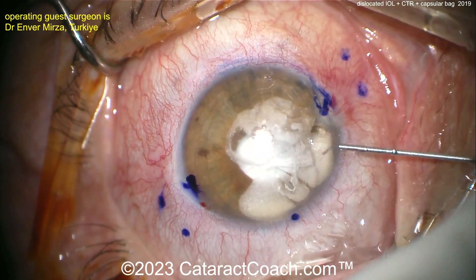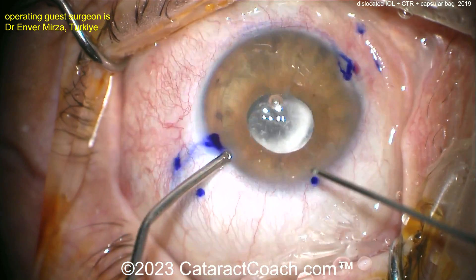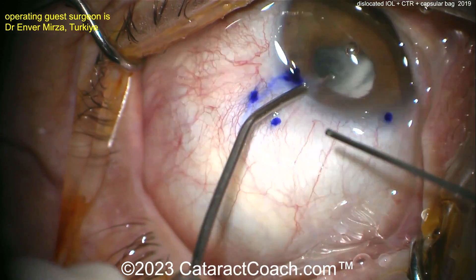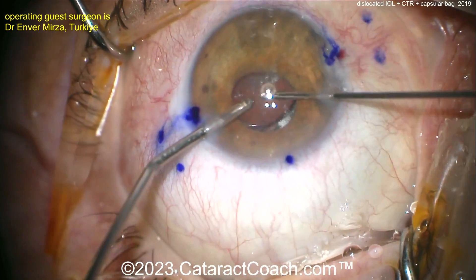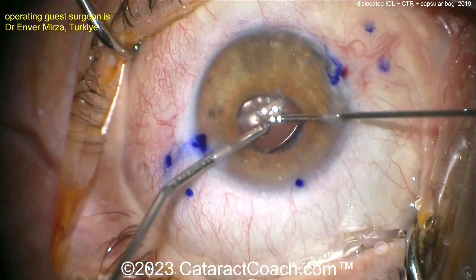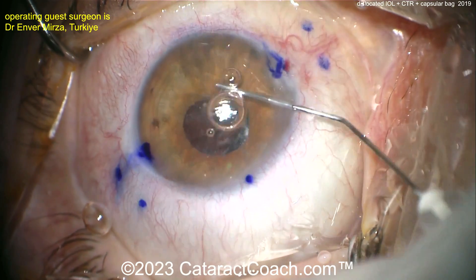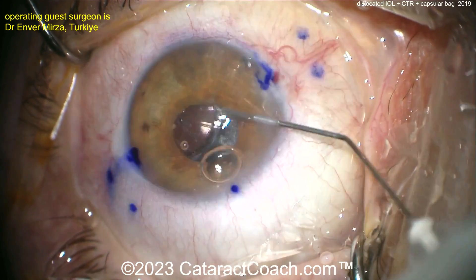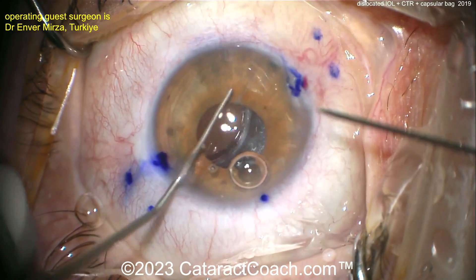Are you going to fold the IOL inside the eye, cut it in half, or use another method? I like the triamcinolone — that's going to help stain any vitreous that's present. Let's see what's going on with the whole lens. Looks like a vitrectomy setup to clean up any entangled vitreous — a smart move, because if vitreous is entangled around the IOL, you don't want to tug on it and cause a retinal break.